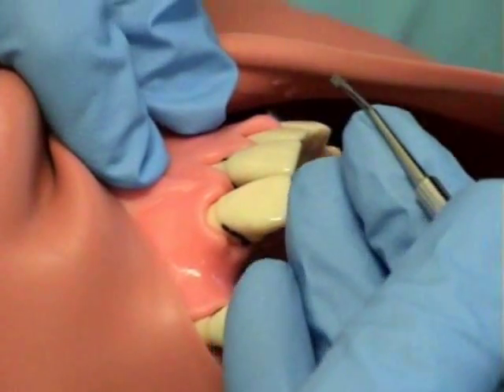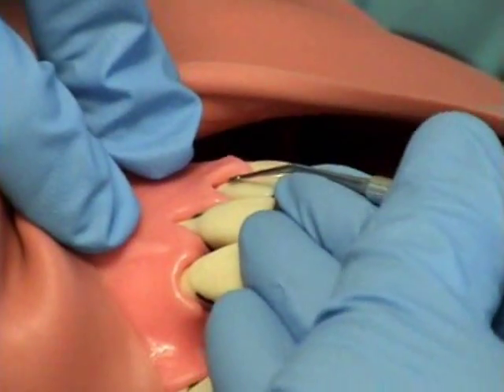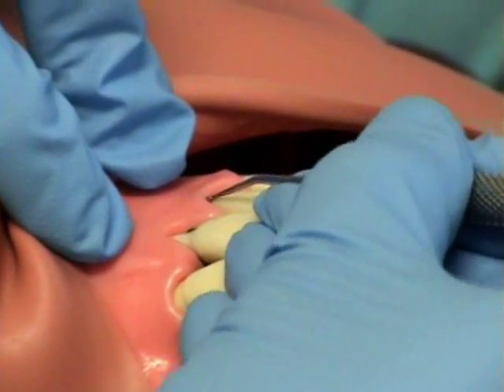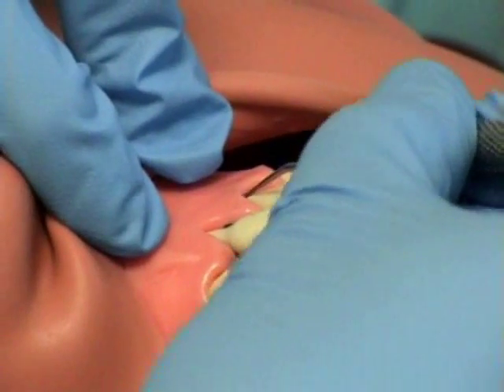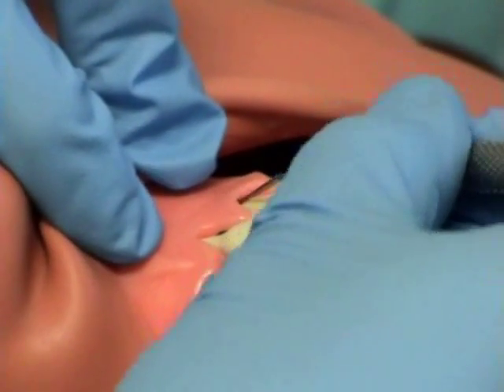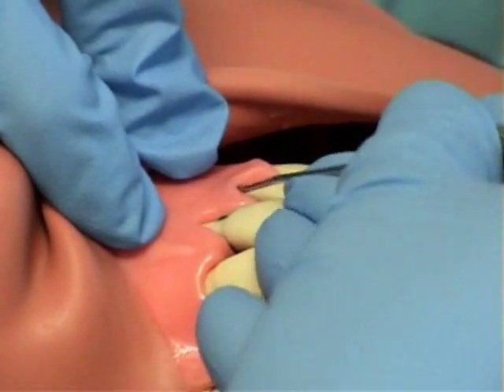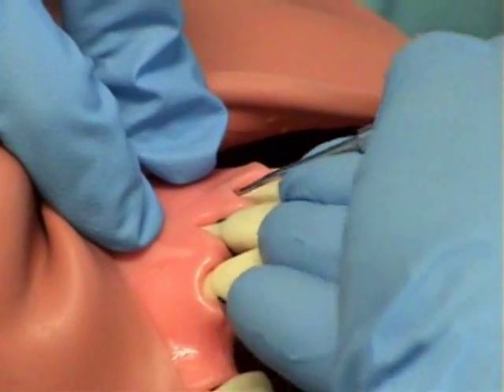Subgingival use of the file must be away from the junctional epithelium. It is used in easily accessible areas. It is used with a vertical pull stroke. The entire cutting edge is placed flat against the area to be treated. The shank is parallel to the long axis.